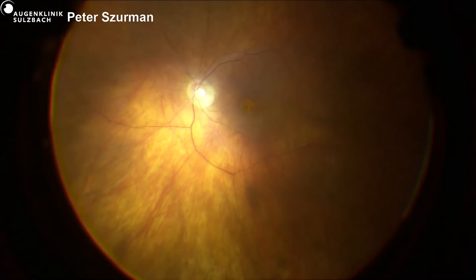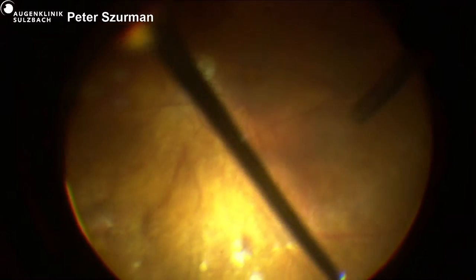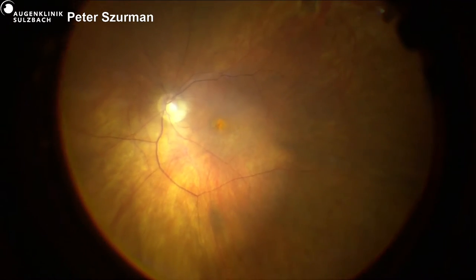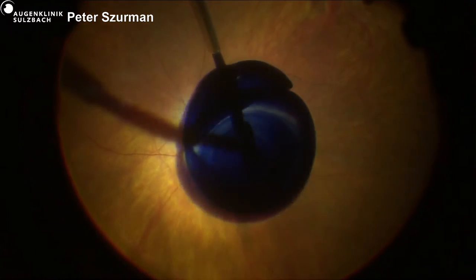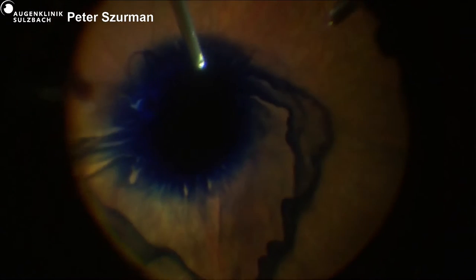Now, I learned this technique recently from David Steel, and I have to say it is indeed really safe. You aspirate into the catheter, you don't run the risk that there is a sticky syringe and you inject all of a sudden, and maybe it happens to inject even under the retina. And so it is really soft, and you can pour it where you want to have it.